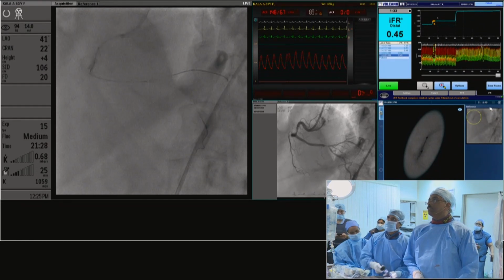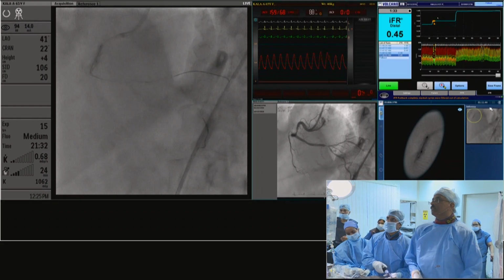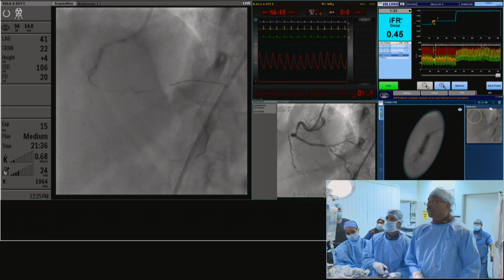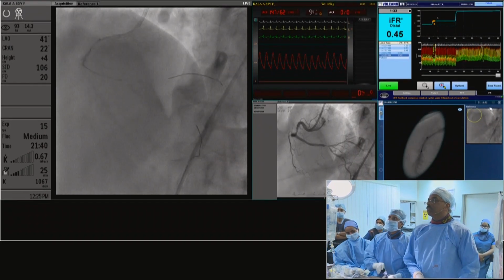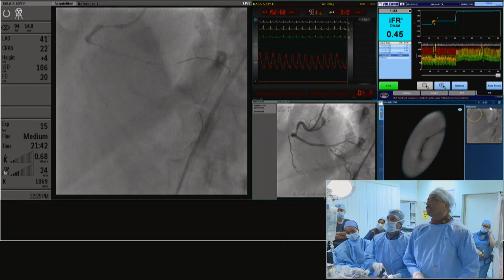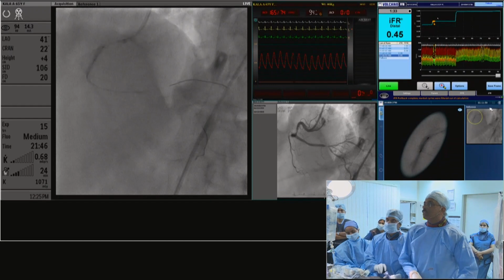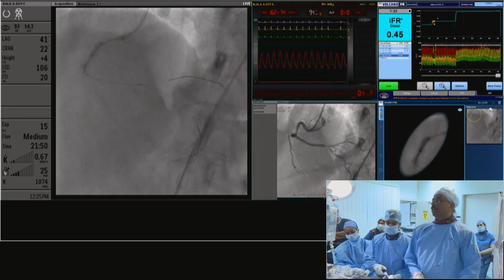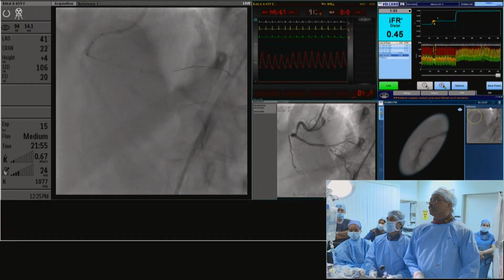I was actually just going to state that this was a very important point, that if the iFR was negative, and therefore one wanted to avoid doing anything and yet get the distal lesion treated, it would be very reasonable to put down a guideliner so that your devices could go beyond the mid lesion, which anyway did not require intervention based on iFR.